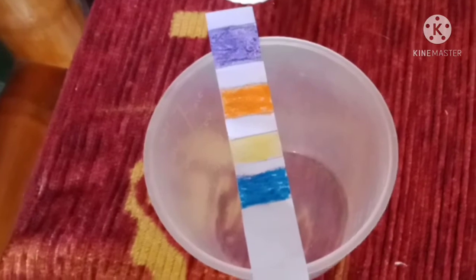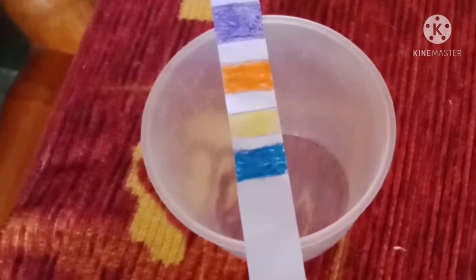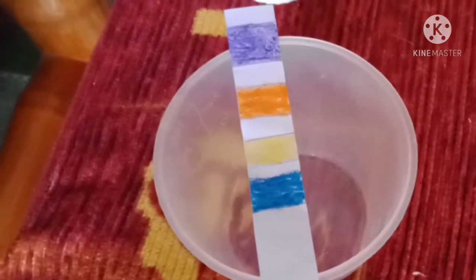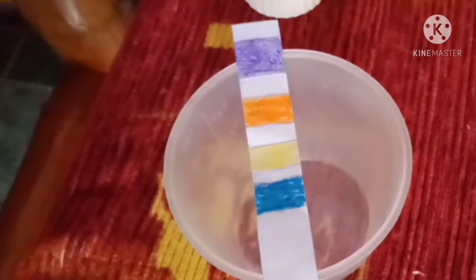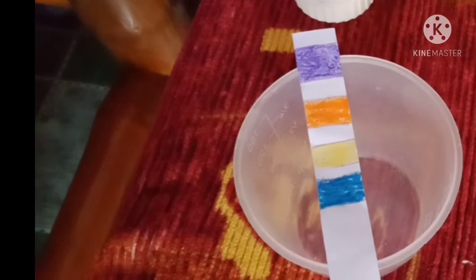Next, we have to measure pH of aspirated GI contents, since it is usually equal to or less than 4, and it is only infrequently greater than 6. In contrast, intestinal aspirates usually have a pH equal to or greater than 7.